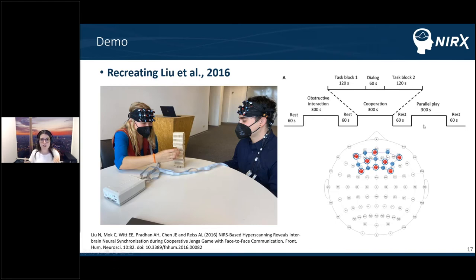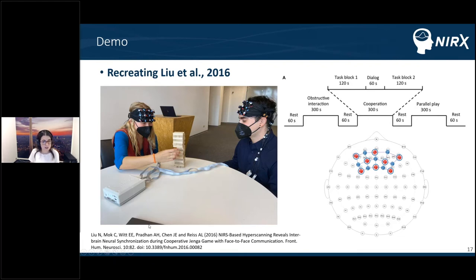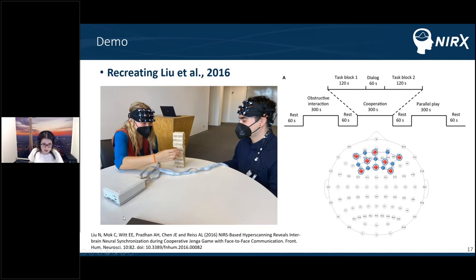We used PsychoPy to automate this process, sending different triggers to simplify later analysis. Both subjects were connected wirelessly from the NIRSport 2 to the recording computer and to the PsychoPy computer — no hardware connection required. Both subjects used the headband montage with eight sources and eight detectors, including short-distance channels on all sources.